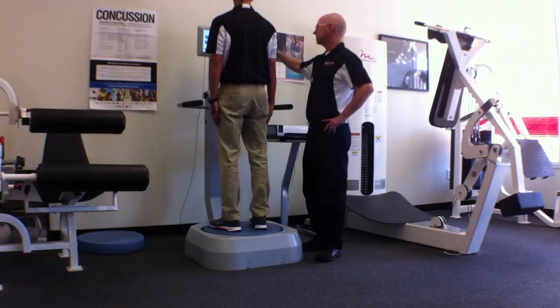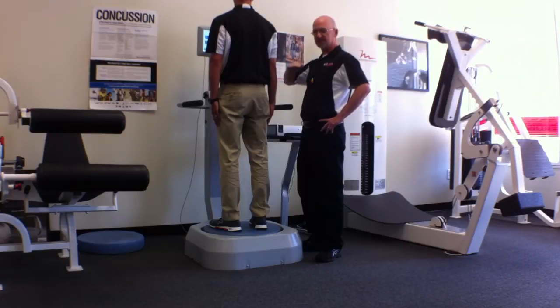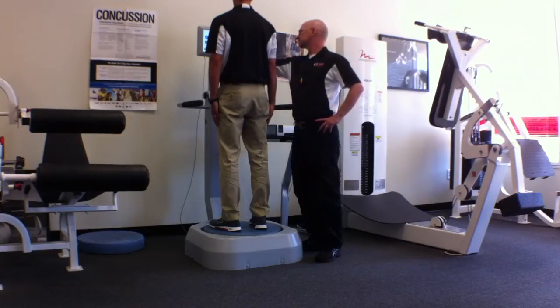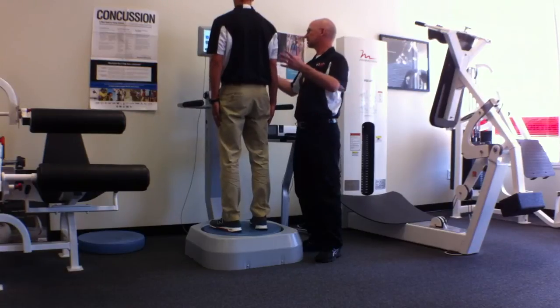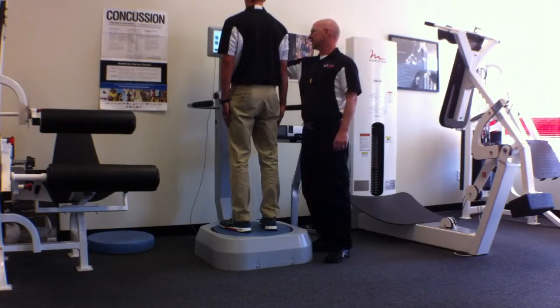What this test is going to do is 3 sequential drops. The platform, they're going to be in 2 feet. Their eyes are open, hands down by their side. When we start it, it's going to collect data for 20 seconds, and it's going to drop the platform stability down a couple of notches. It unlocks, kind of gets them ready to the first level, which is a platform setting of 12. And then we're going to collect data.